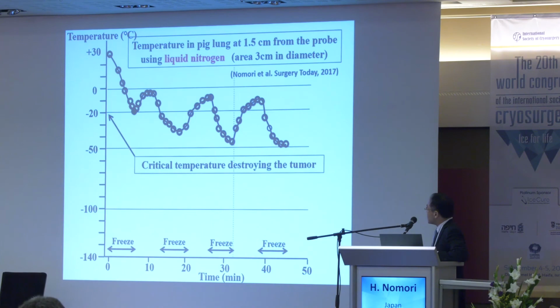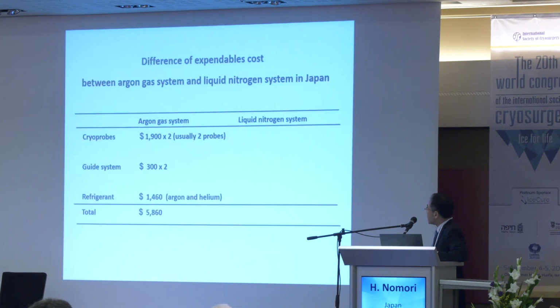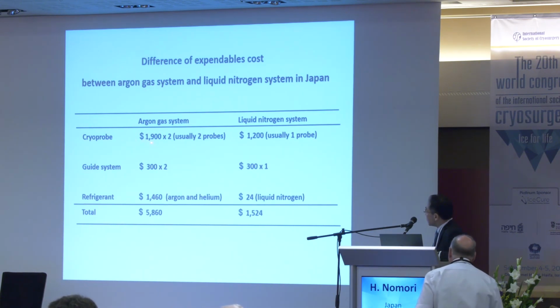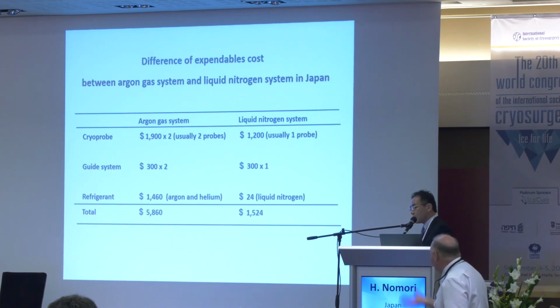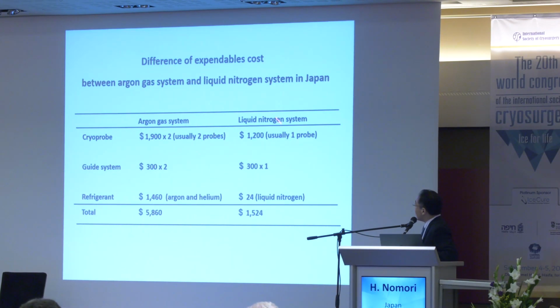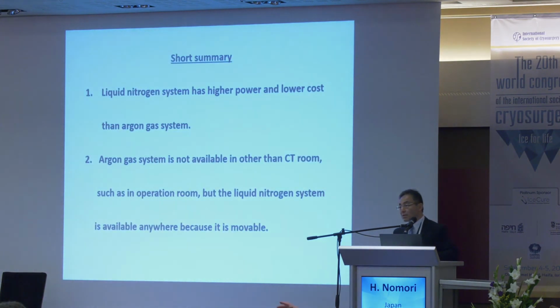And this is the temperature. And this is the expendables cost. Argon gas is higher than liquid nitrogen. So that's the end. Thank you.